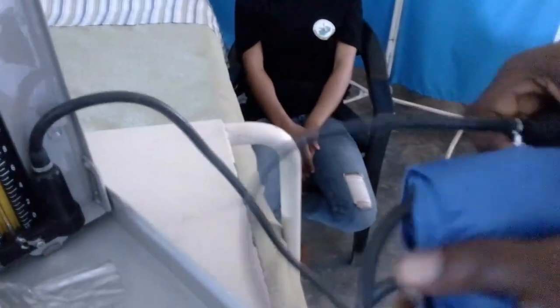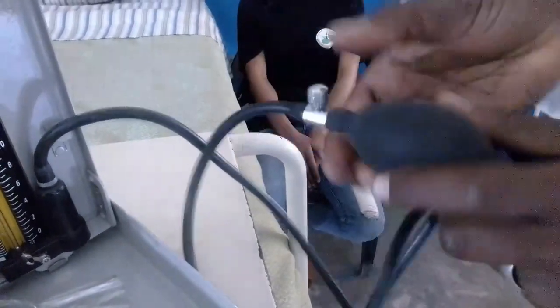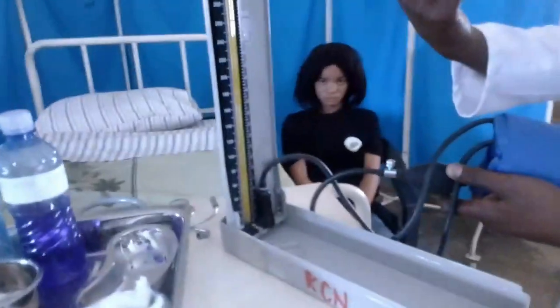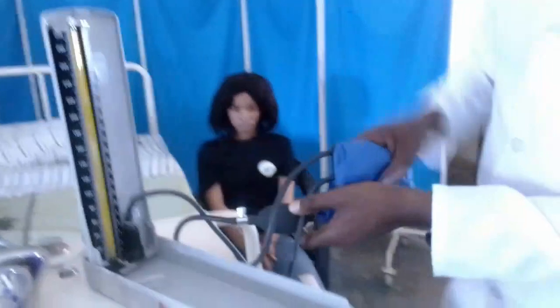So let's see what happens. Let's close the knob here. The knob has been turned on, meaning it's blocked. Then let's pump. As you can see, the mercury is rising. So that's the technique, you just need to know how to use it. The knob will close and then the mercury will rise. And when you open the knob, air comes out, meaning the cuff will be deflated.